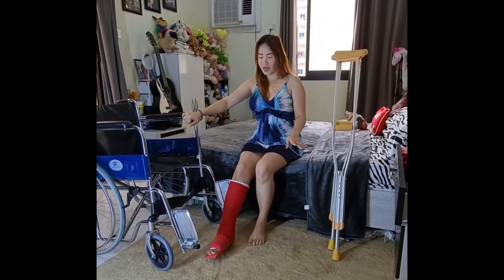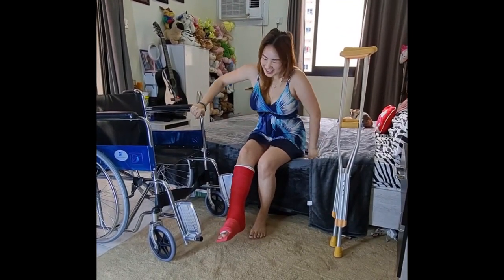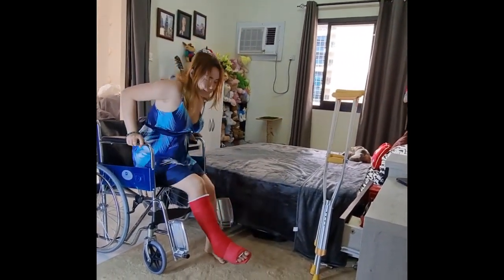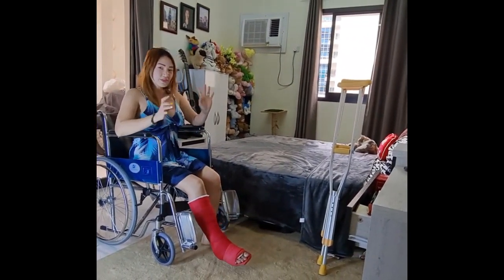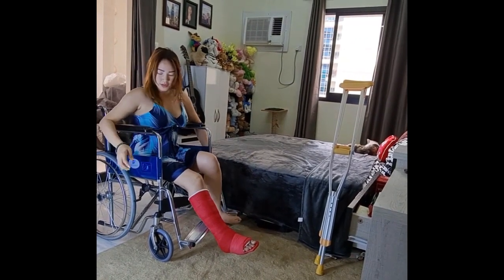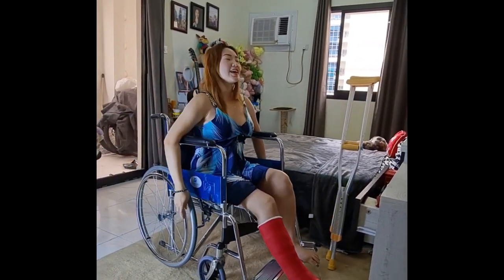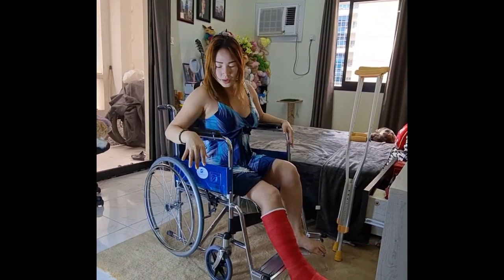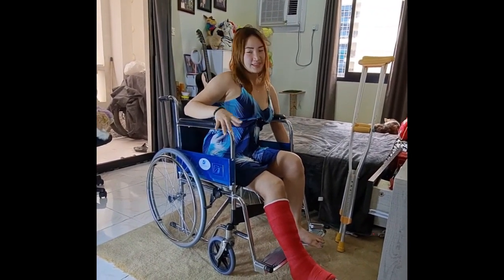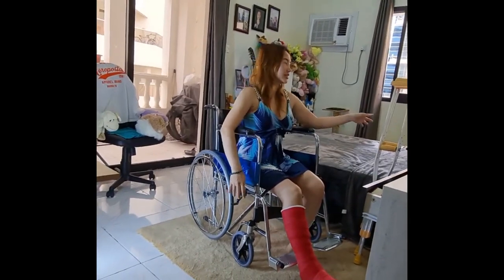I'm going to show you using the good side and the weak side. I do like this, touch here, and then done and finished. After that I can manually unlock it, then go forward — done. Every time I'm stopping, I should lock it to avoid the wheelchair rolling or going out of balance.